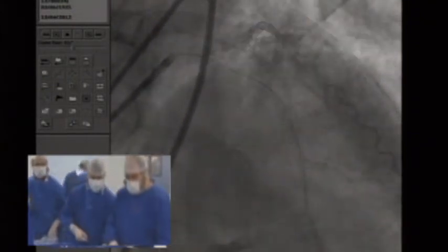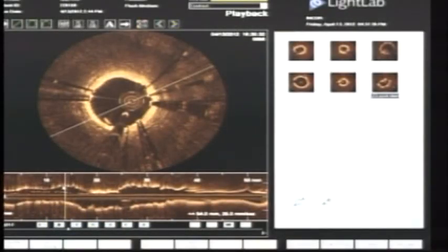Helmut, you would use a long stent there, or stent both lesions? What would be your approach? You put a small stent in the distal lesion, maybe 11 millimeters, and a long stent proximal. Yeah, I think it's difficult to spot stent this proximal lesion. No, the proximal I think is diffusely diseased. You know, this LAD distal lesion, you can't call it small, you can't call it distal. This LAD wraps around the apex, and I think that's a fairly significant LAD. You would touch it. Definitely would. It requires a short, small stent.